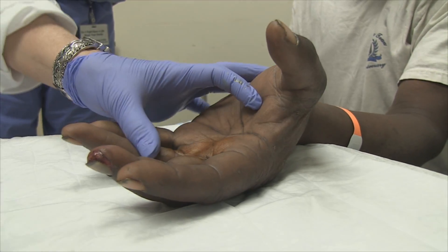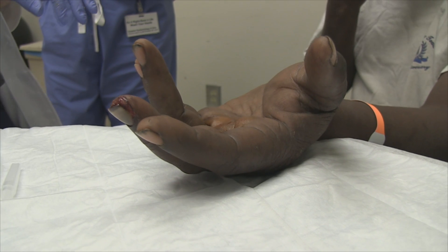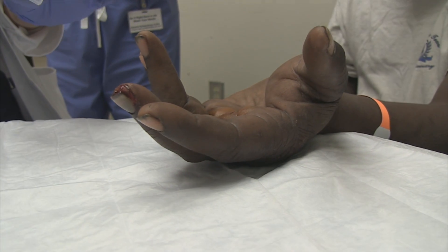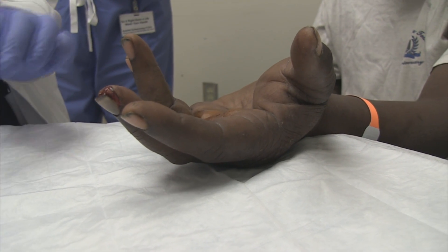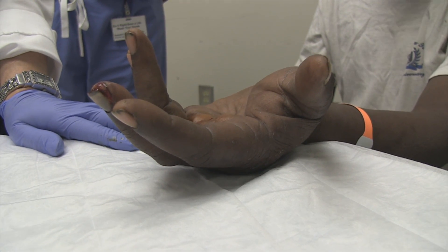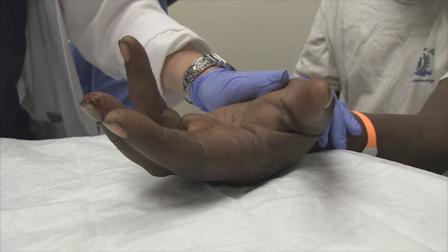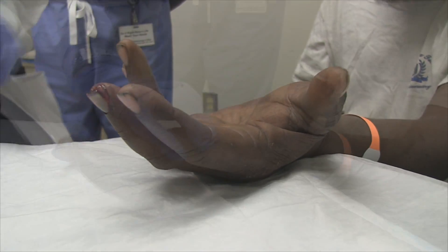Our operator today is a nurse practitioner, and you're in a training program for emergency medicine. That's the first metacarpal block you've done, correct? Yes. The patient's looking at us like, oh no. I didn't tell you that first, did I? I've done digital blocks, but I haven't done a metacarpal block.